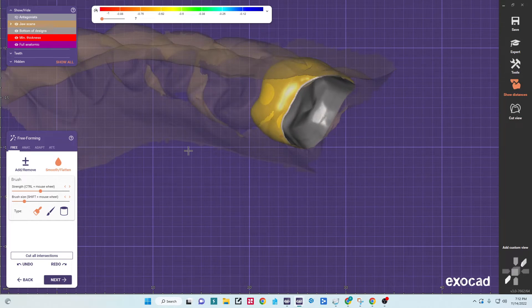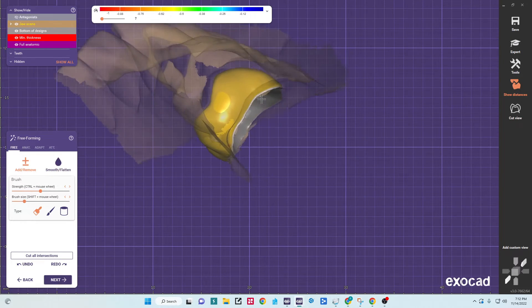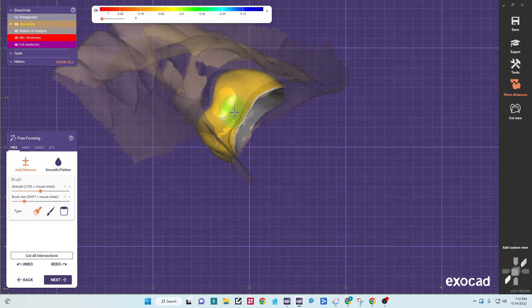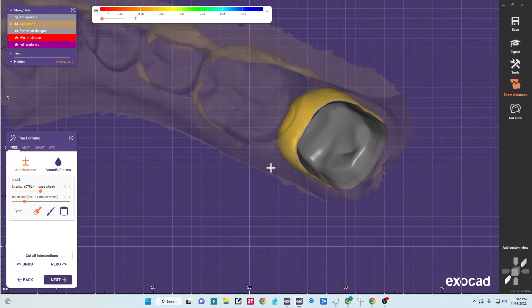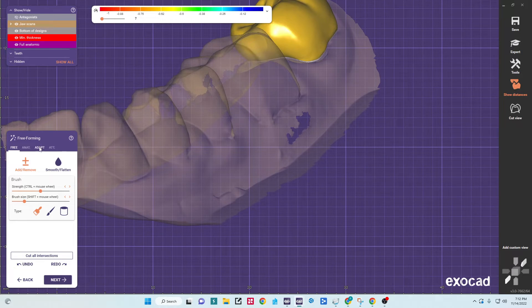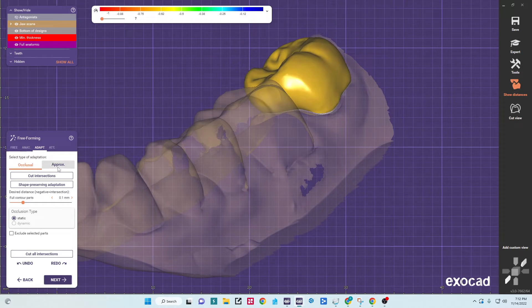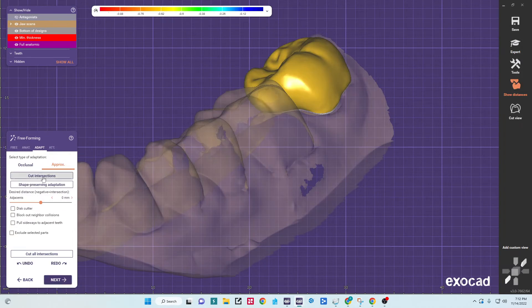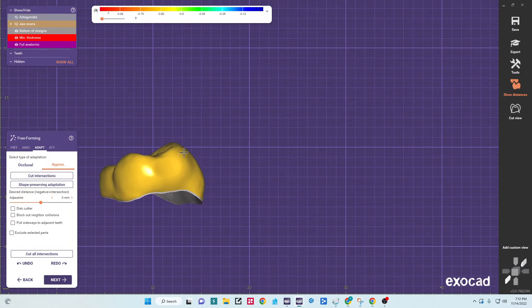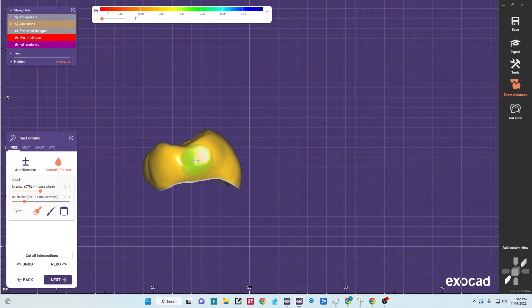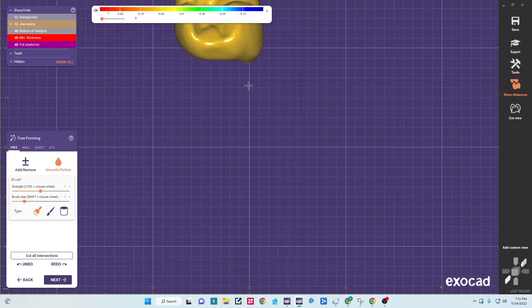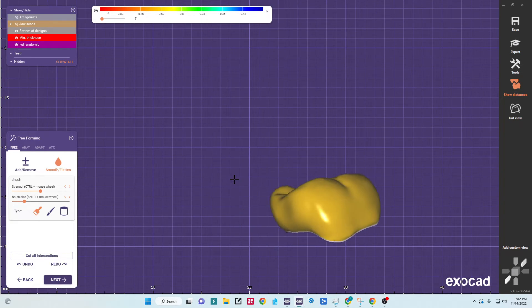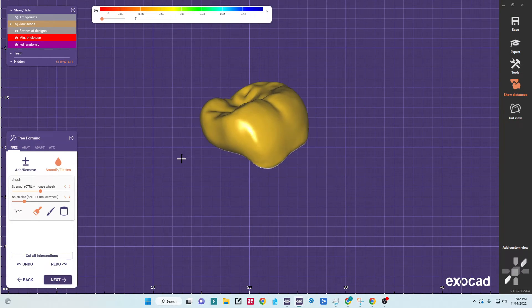Okay, the other tool we have in here that is helpful is, say we do over-bulk our contact here and we've got it sticking through to the neighbor. We'll go to adapt, occlusal, interprox, so this is interproximal cut intersection. And you can see it cut away to an exact. So I like to cut there, go back to free form, smooth flatten, and hit it just slightly. That way we have a nice broad contact that will adapt nicely to the neighbor, but it's also smooth so it doesn't catch floss.